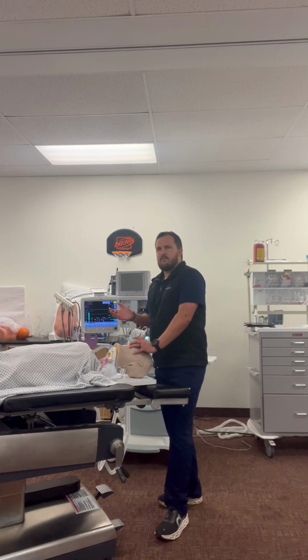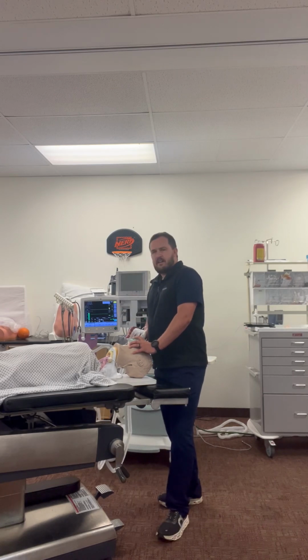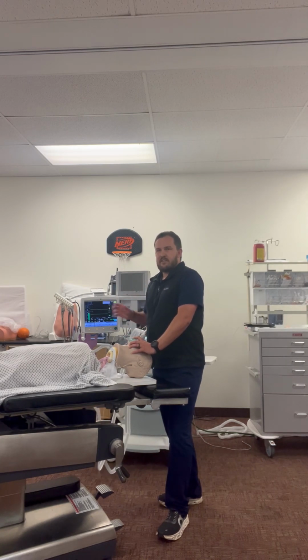And then while I'm doing that, I'm going to be looking at my monitor. I should see an increased FA/FI ratio, so my FI should be much higher than my FA, but I should see the FA slowly climbing up. And that just means that my ventilator is working appropriately with the anesthetic gases.